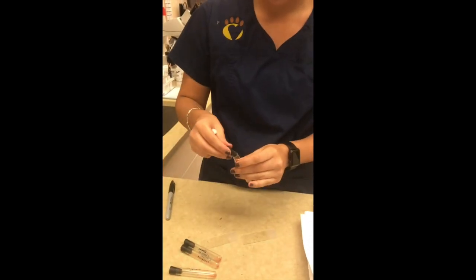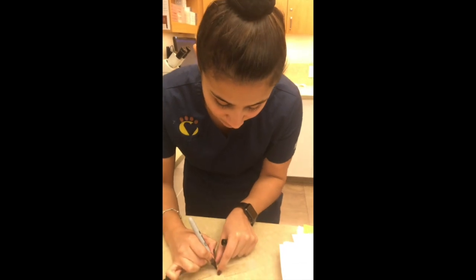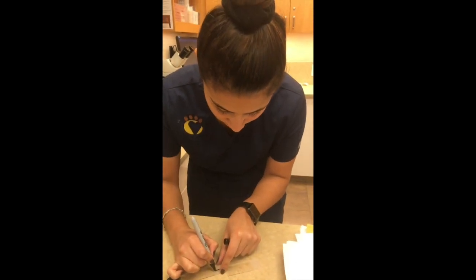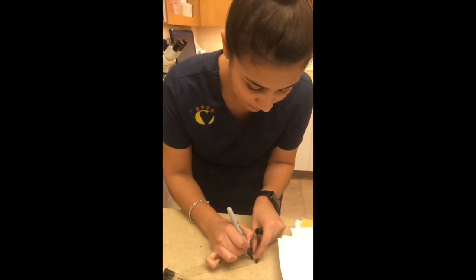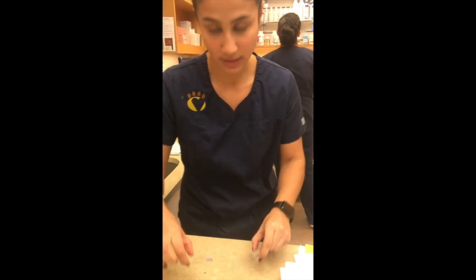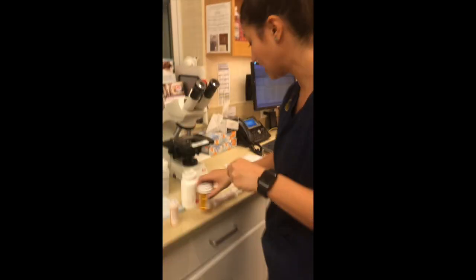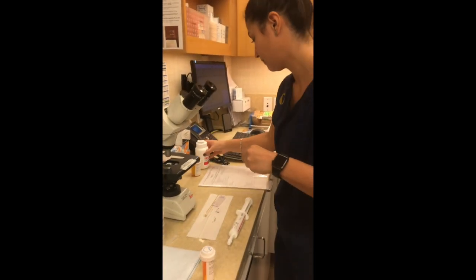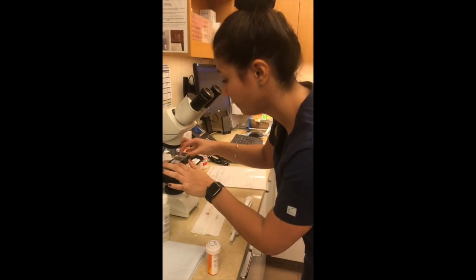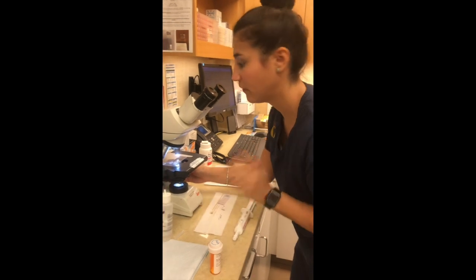Perfect. Now I'm going to label both of them as major and minor. Great. Now I'm going to take a look at the slide. We're just going to look for any hemolysis. So first I have our minor. So I'm only keeping it at a low power view.